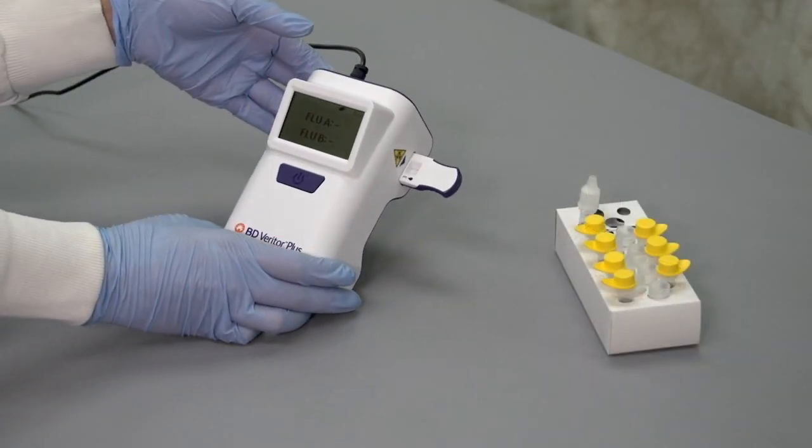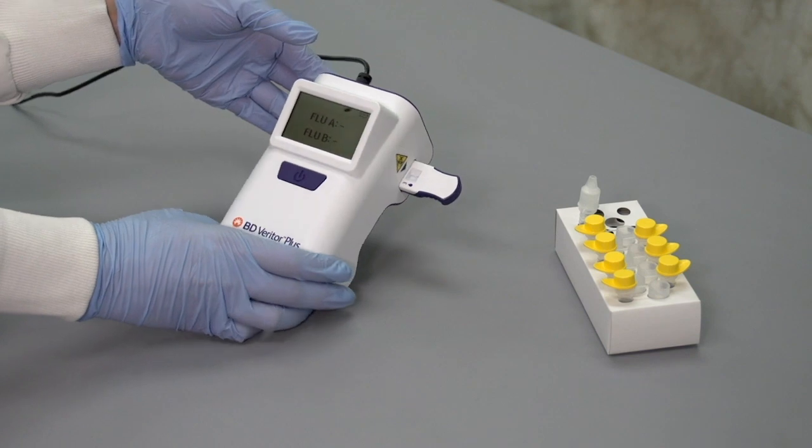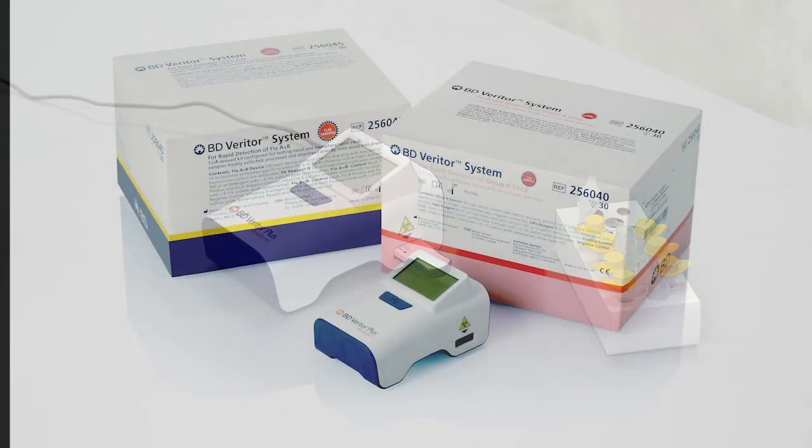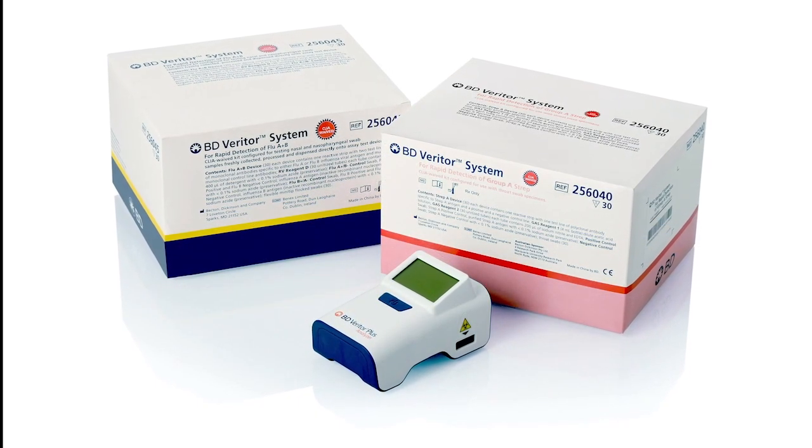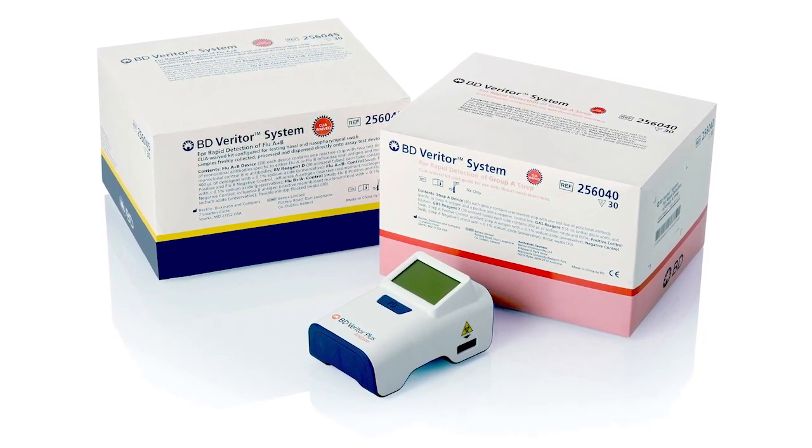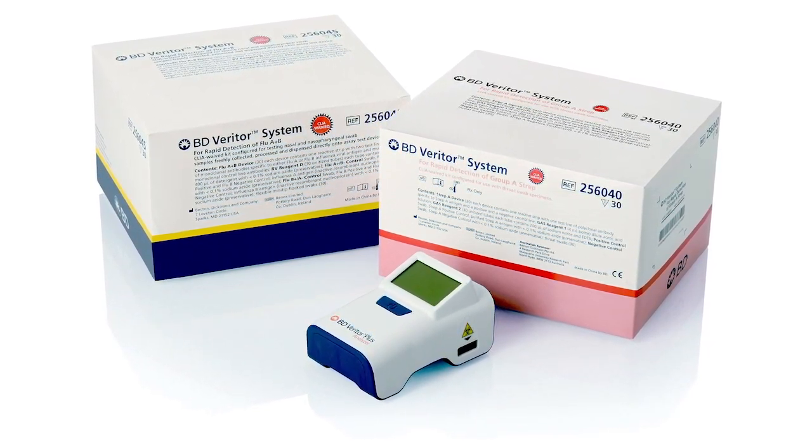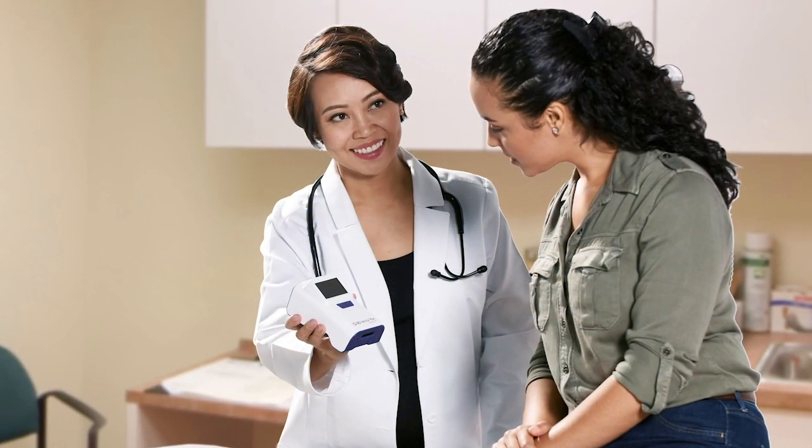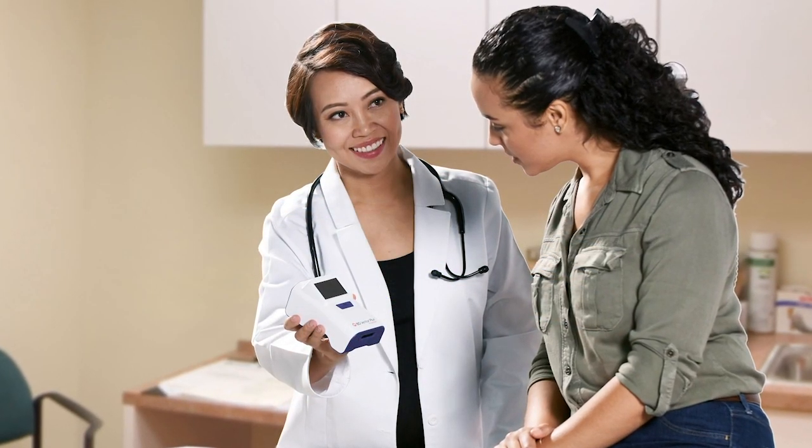The test result remains on the display screen as long as the test device is in the instrument or until the auto-off period is reached, either 15 minutes on battery power or one hour with the power adapter plugged in. Make sure to record the test result before removing the test device.